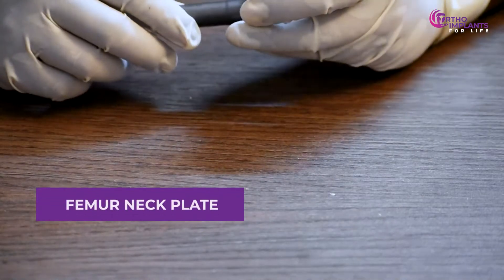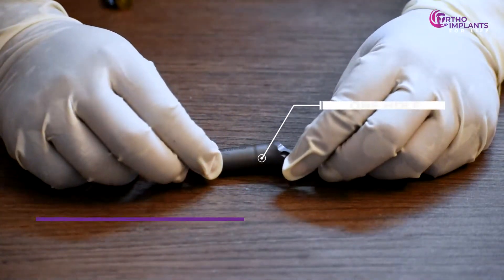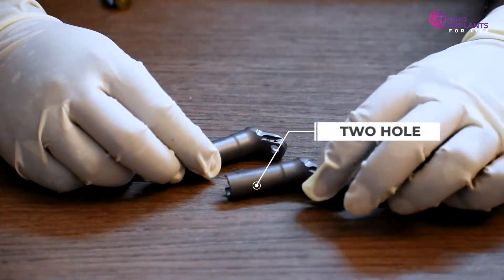This is the femur neck plate which comes in both one hole and two hole variations. This one is the one hole, and this is the two hole variation.